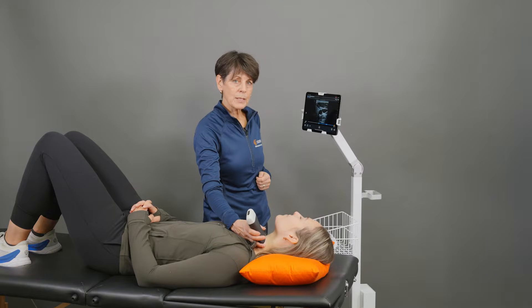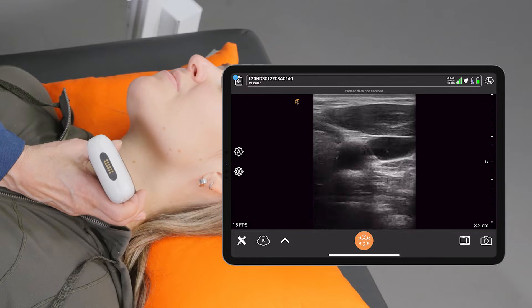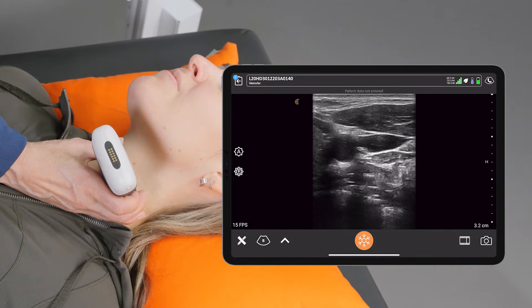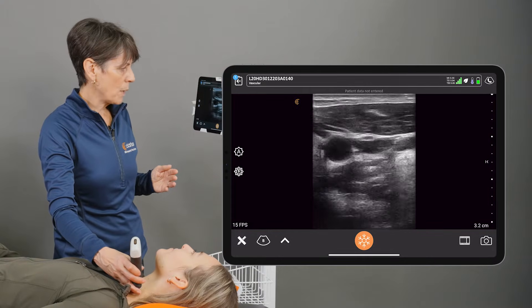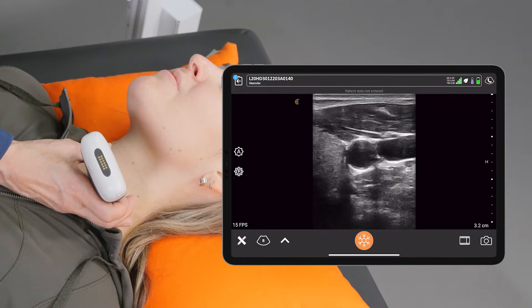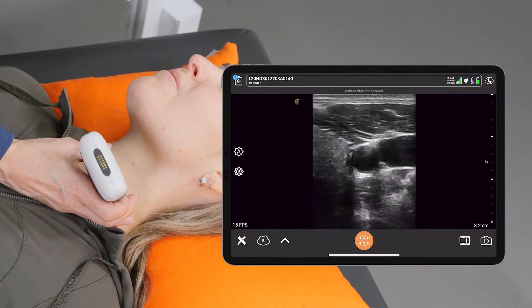The first one we'll talk about is fanning. I'm looking at the carotid artery here just because it's a nice big structure to demonstrate. I've got my scanner cross-sectionally on the neck, and what fanning does is this type of movement — staying on the same spot but just fanning the probe up and down to optimize the image. Things get clearer and then not so clear, so you just want to fan your scanner until you get the best image possible.